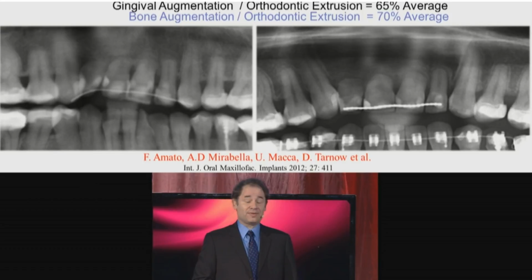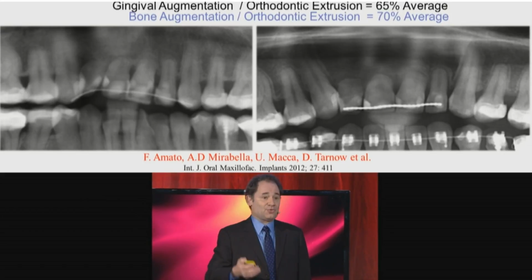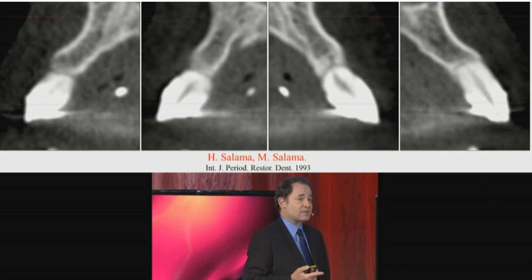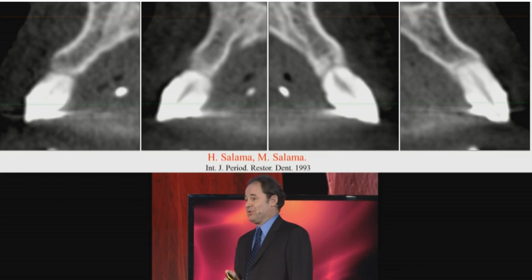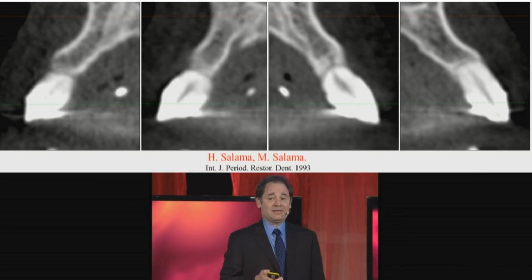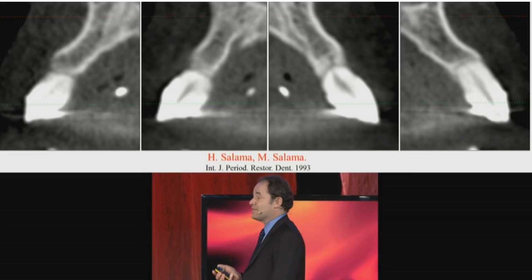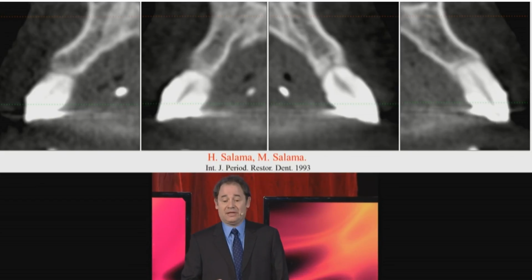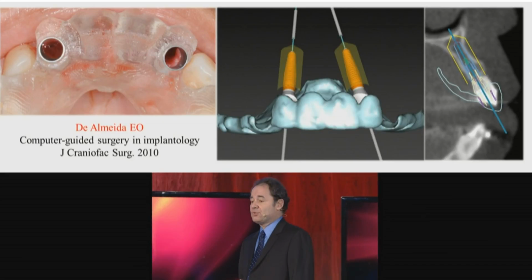And to the point that we're going to have flapless surgery, very simple extraction, and just with guided surgery. No augmentation of any kind was done. And when you look at those pictures right before extraction, this is an exact illustration of what Henry and Maurice Salama told us 20 years ago. And that is, you can utilize hopeless teeth for the implant site development through orthodontic eruption. So we gave it a chance. The patient knew maybe it might not be predictable, but we tried. And so very simple guided surgery.